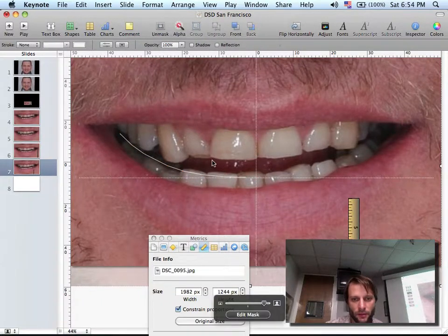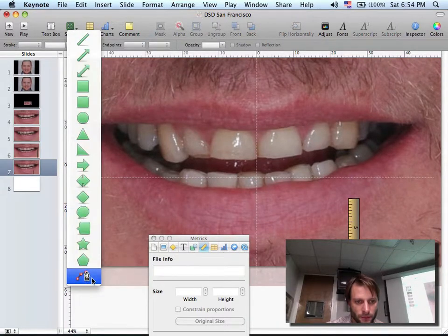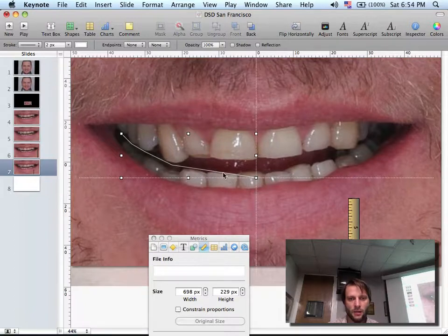I'm gonna even make it more simple here. If you have, let's say, you like the molar, you like the position of the first bicuspid, maybe the cuspid needs to be a little longer, and you have this. Now I just need to add some in-between points here to improve my curve. One way or the other.